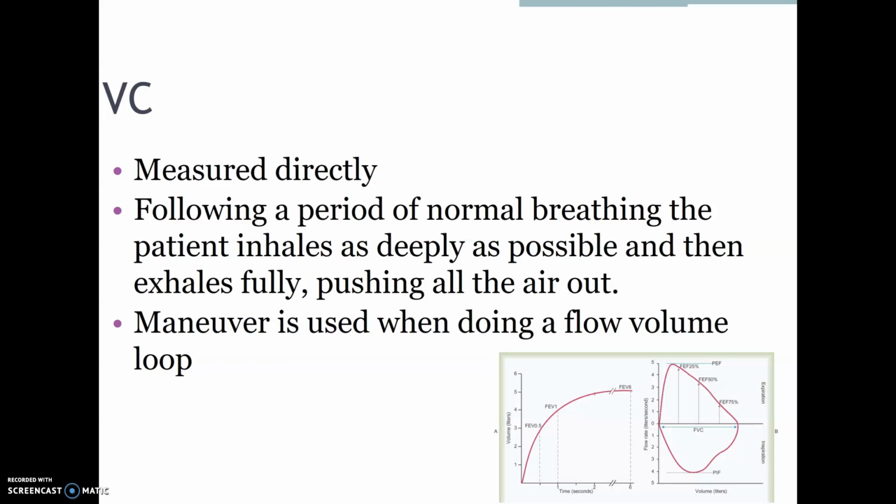Okay, so this is video 4 for pulmonary function testing, and we'll start with talking a little bit about vital capacity. Vital capacity is directly measured from spirometry, which means if you do a PFT test, then you can go ahead and measure the vital capacity directly from that.